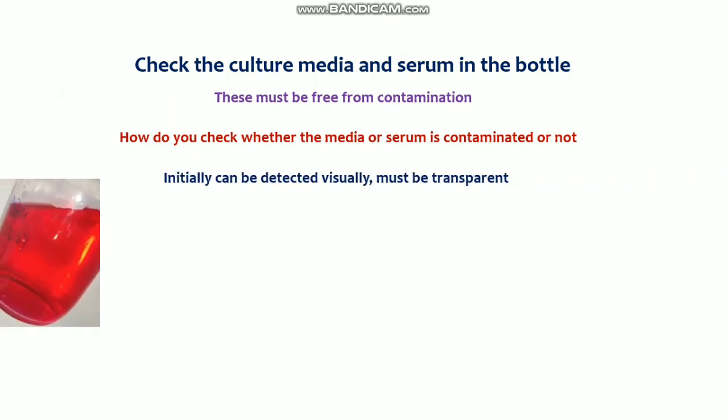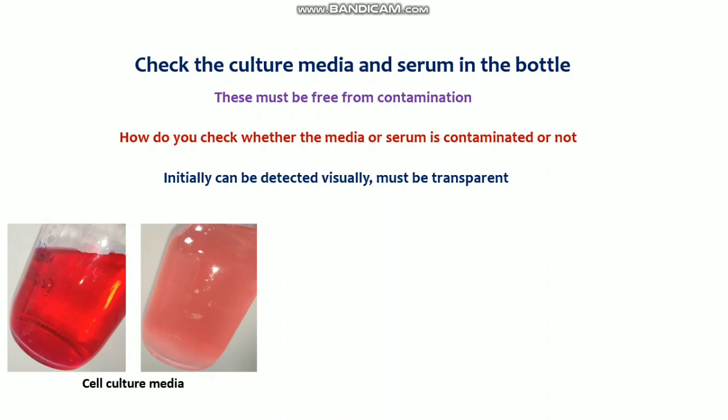For that, initially you can detect visually, because it must be transparent. Here, as you see, the first cell culture media is very transparent, so you can assure that there is no contamination, at least at the initial level. But the next one, if you see some kind of turbidity, then just discard this kind of media.